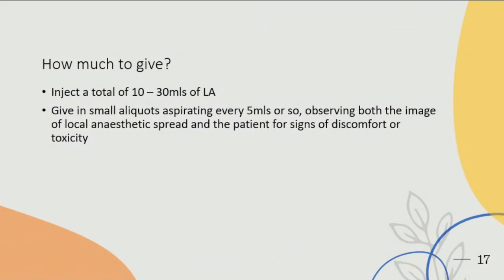Yeah, you must always check whether you are at the right position, at the same time with your eyes fixed on the ultrasound screen. Make sure your LA is depositing at the right place.